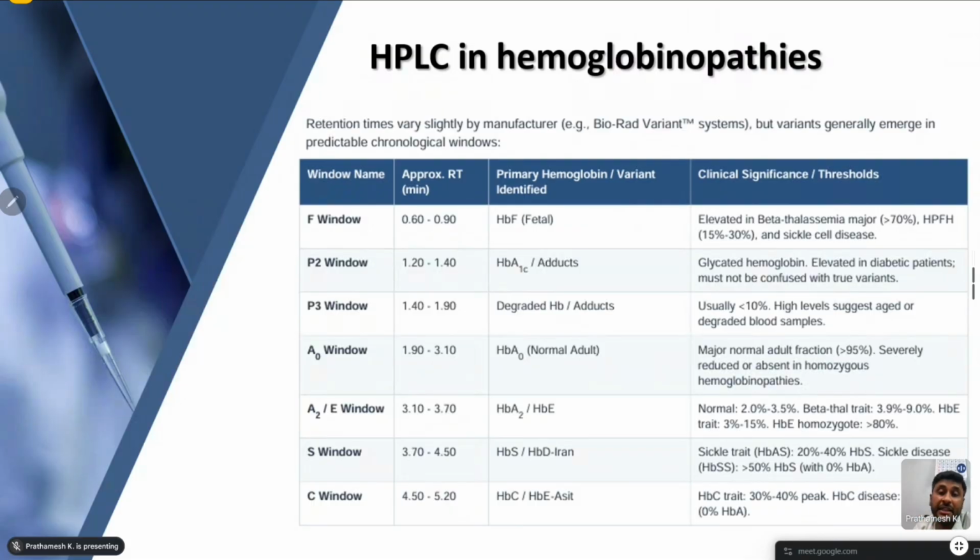Coming to HPLC in hemoglobinopathies. So principle remains the same because the analyzer is same. सब कुछ सेम रहेगा, खाली आपके बफर्स में थोड़े चेंज हो सकते हैं, बिकॉज बेसिकली वहां पे A1C को सेपरेट करके आइडेंटिफाई कर रहे हो. यहाँ पे हीमोग्लोबिनोपैथीज में आप हीमोग्लोबिन के अलग अलग टाइप्स को सेपरेट करके आइडेंटिफाई कर रहे हो. ठीक है. तो आपका प्रिंसिपल वही है, कटायन एक्सचेंज HPLC.